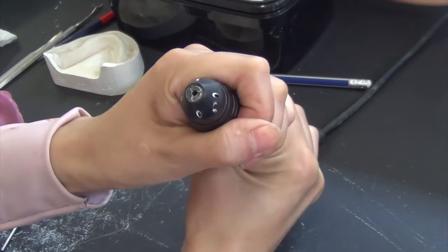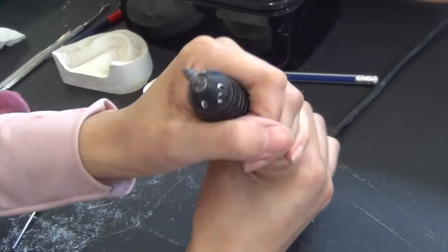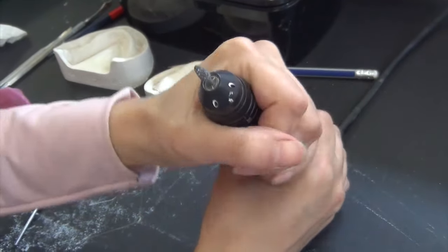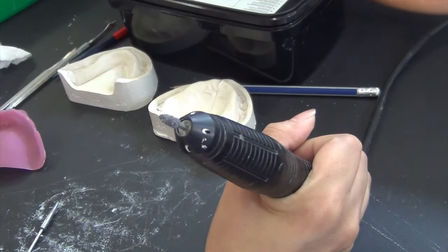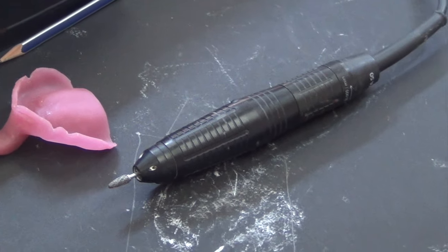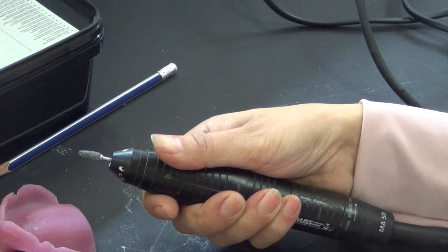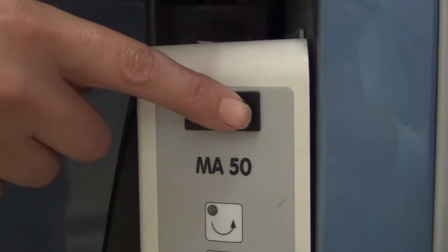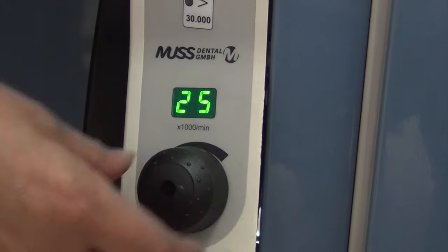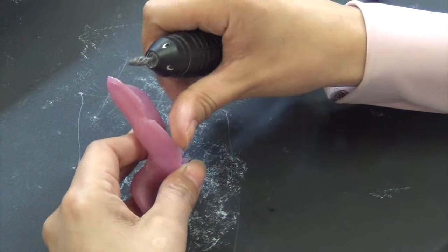Once the tray is fully cured, it is time for finishing and polishing. For this you are going to use an acrylic burr fixed on a straight handpiece. The correct way to hold a straight handpiece is by using the palm grasp — hold the handpiece with your palms and use your thumb to provide support. Turn on the straight handpiece motor, set the speed to 25,000 rounds per minute, and push the switch with the side of your leg to operate the motor.